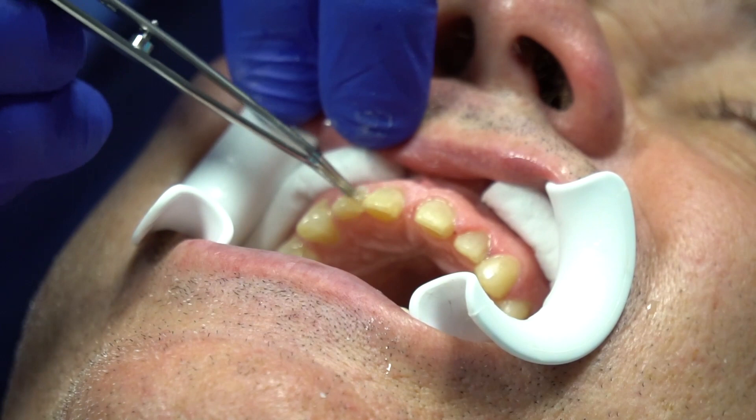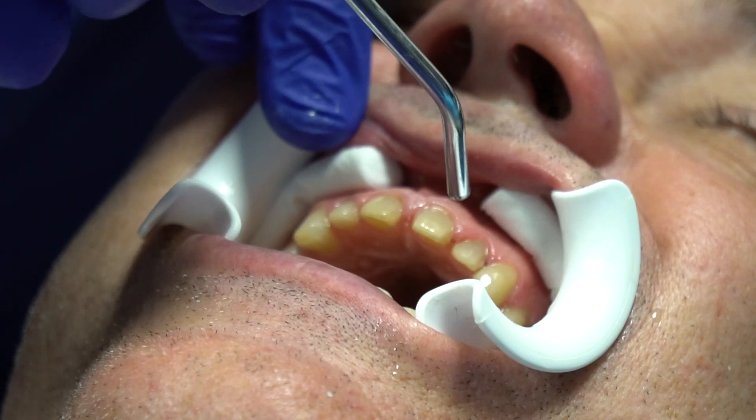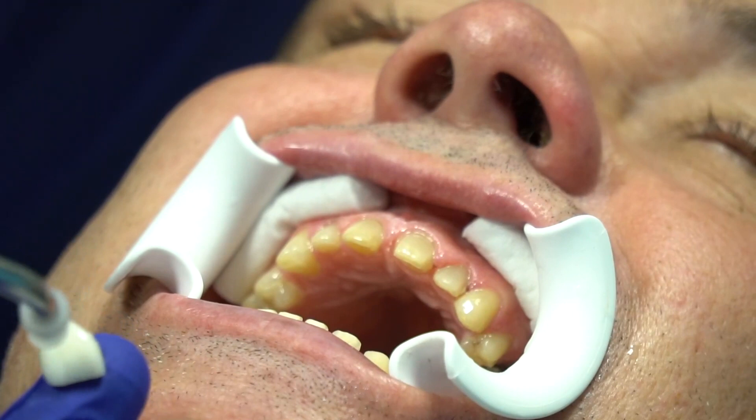We blow this area. You can blow the Tenure S a little thicker because it's a thicker resin — the thicker the resin, the harder you can blow. This is that little suction-driven thing. This is when I want to look for bubbles — we don't want those.